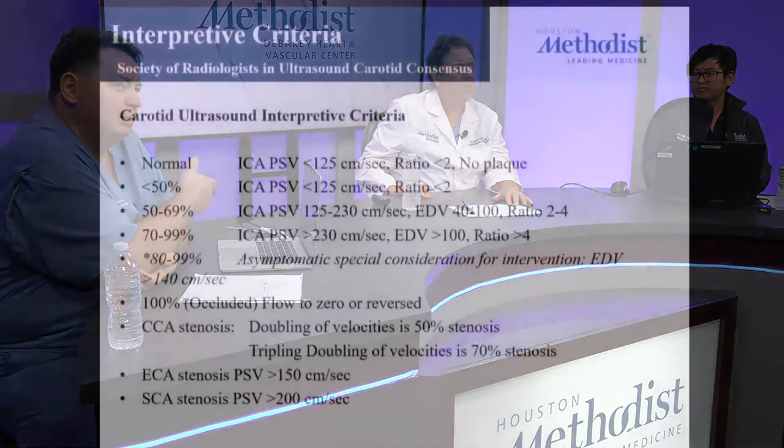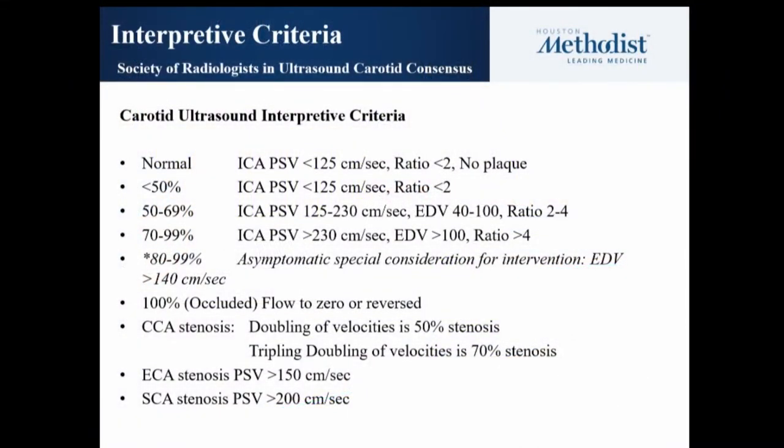And also that asymptomatic, I think, is very important that we see is more tailored also for the stenting criteria. When we had, for example, the CREST indication, it was only the ratio. Ratio over four was one of the enrollment criteria. Didn't care about PSV or end diastolic. So that is another guarantee that a ratio of over four is going to give you that value and credited 70%. Okay. And then in the next slides, I'm going to show you why the 70% is important.